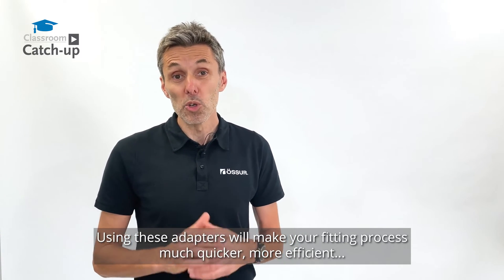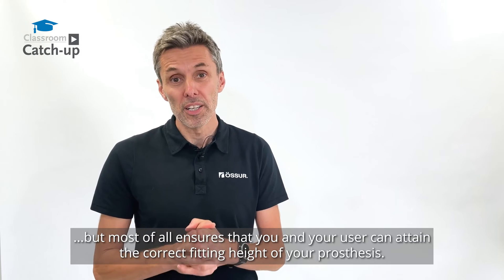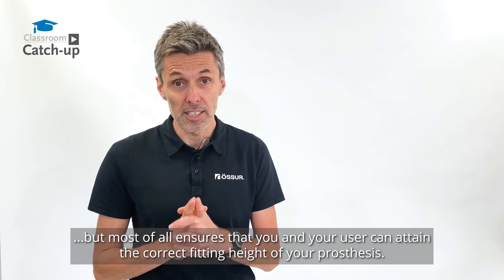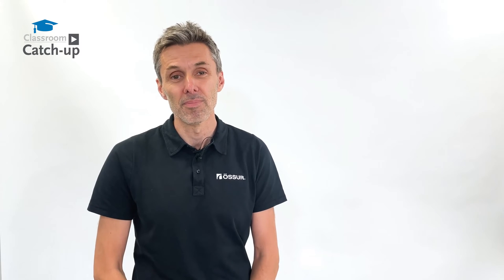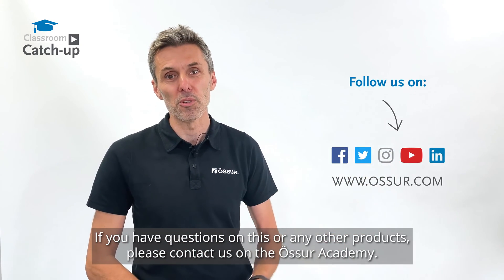Using these adapters will make your fitting process much quicker, more efficient, but most of all, ensures that you and your user can attain the correct fitting height of your prosthesis. If you have questions on this or any other products, please contact us on the Össur Academy.